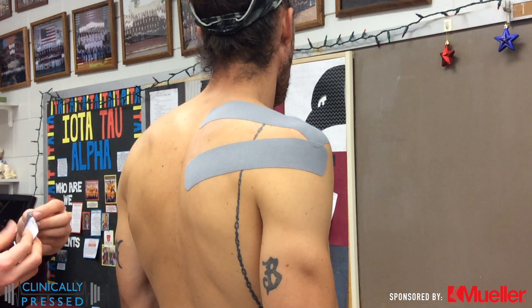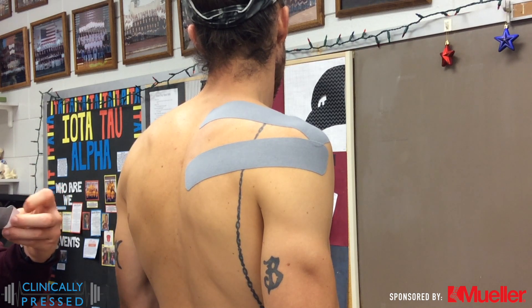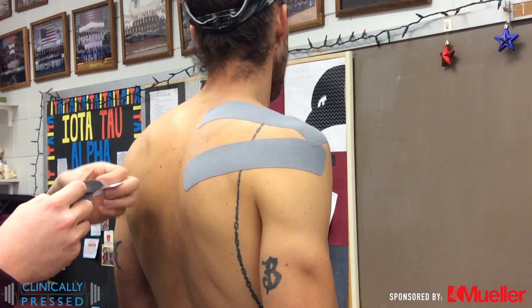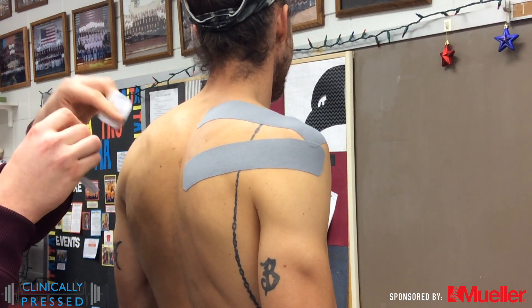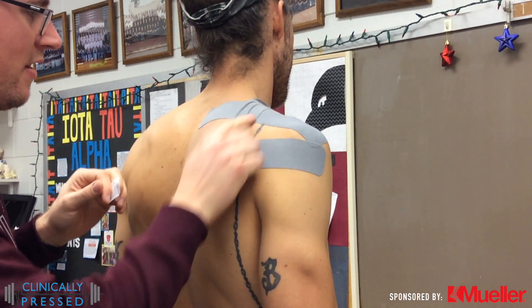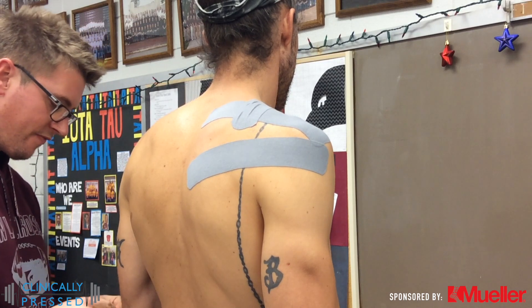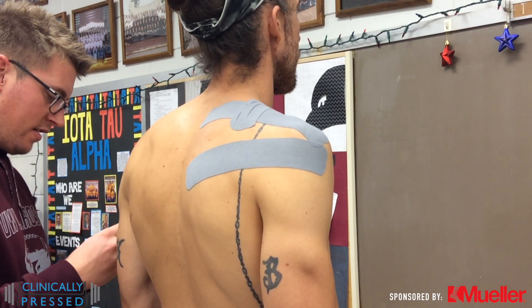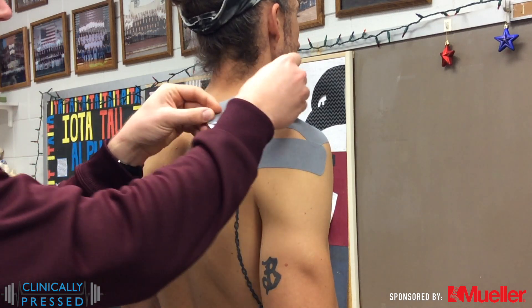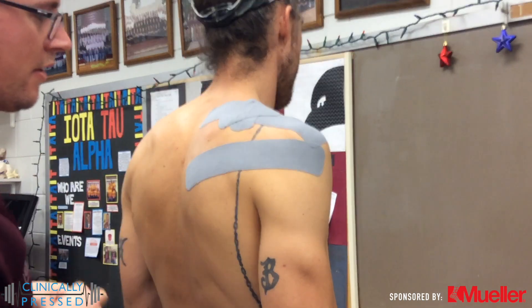We're also going to demonstrate the decompression strips, and you can use these along any point of the muscle. From discussions with other physios and athletic trainers, these are very beneficial for trigger points within these muscles. It's something you could utilize, and also again just to help reduce pain. As with all our other videos, the same principles apply — tearing from the middle, applying tension all the way through the strip of tape, laying it down evenly working out from the middle, and then gently laying down those two anchors. For this one we went directly across, and we'll put on one diagonal strip — you could add more if needed based on your clinical outcomes.